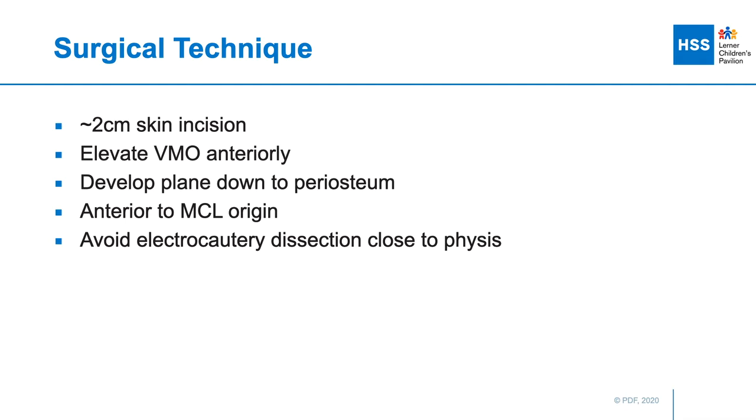We dissect down to the VMO, where the interval between the VMO and the posterior structures is developed by elevating the VMO anteriorly. This plane is carried down to the level of the periosteum, anterior to the MCL origin. I like to avoid the use of electrocautery around the physis so as not to permanently damage or cause iatrogenic injury to the periphyseal ring.